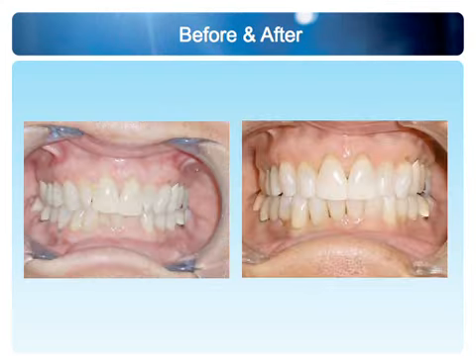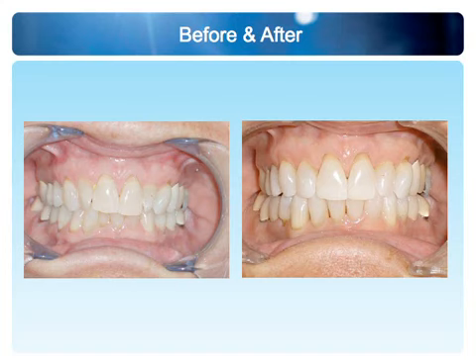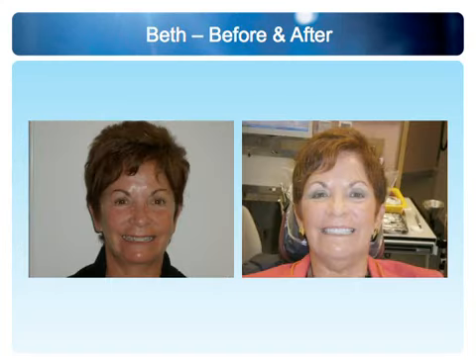I'm a big fan of the lingual bar, by the way, so I like to keep all 4 incisors and have the patient have a nice occlusion at the end of the case, with teeth that are upright, proper arch form, proper arch width, and in the end we get the smile. It's almost incidental that the smile will occur, because as you develop width, you fill in the sides. A little bit of bleach gel goes a long way, and so I recognize this photo is a bit darker. The teeth were not that brown to begin with. The whole photo is a bit darker, but a little bit of bleaching and Invisalign goes a long way.